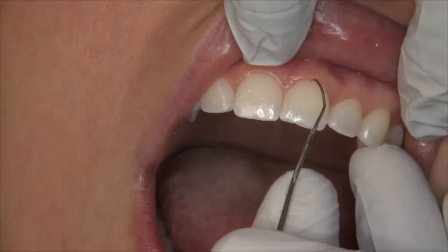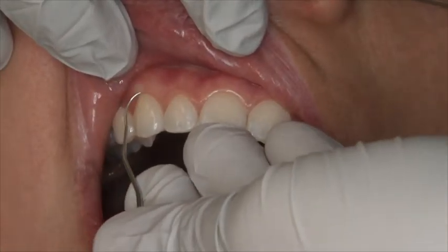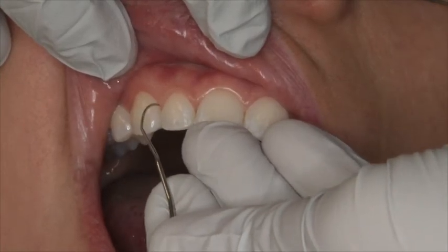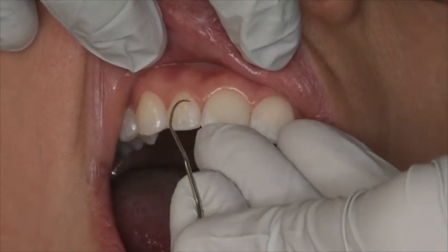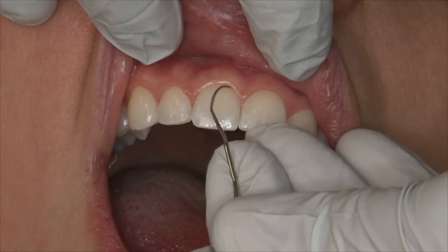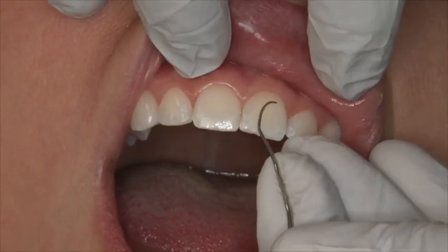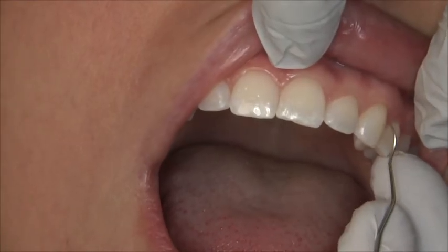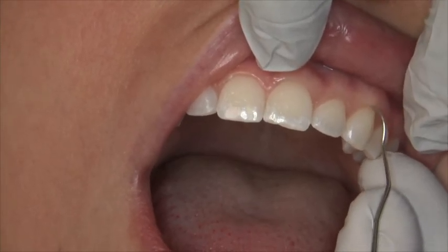Do not flip the instrument until the entire sextant is explored. Anterior teeth surfaces towards — facial and lingual — should be explored beginning with the tooth furthest away from the practitioner in the sextant. Insert one to two millimeters of the side of the tip of the Explorer at the middle of the tooth. Oblique and vertical strokes should be used to explore between the gingival margin and the junctional epithelium into the interproximal area. Instrument across the sextant in the direction of the tip. Surfaces away — facial and lingual — should be explored in a similar fashion beginning with the tooth closest to the practitioner in the sextant, working in the direction of the tip.